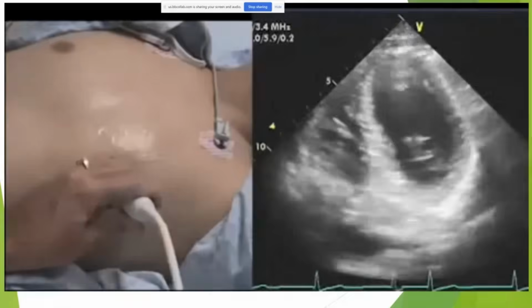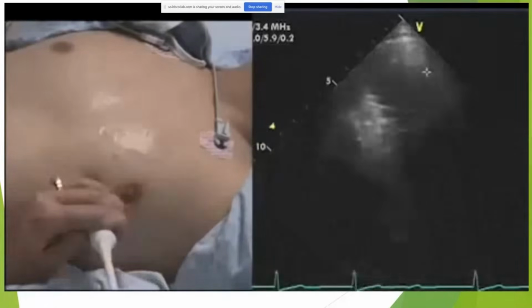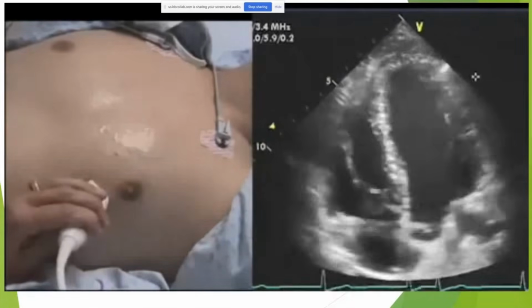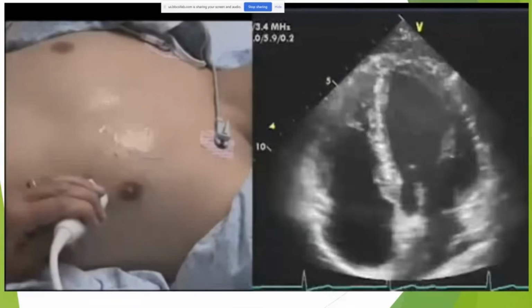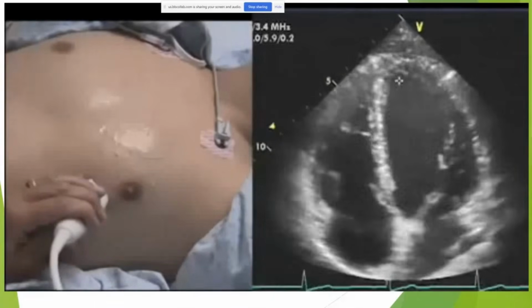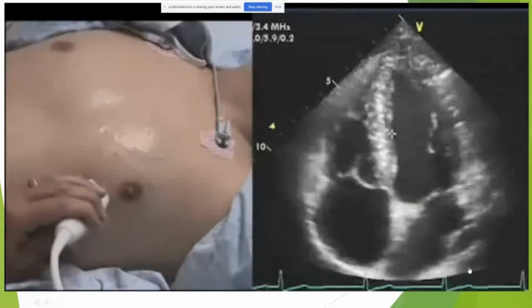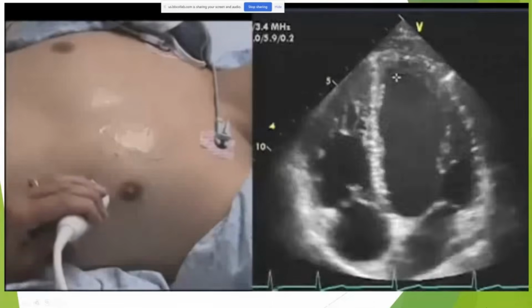So often, in this case as well, you need to find a lower window and angle steeper, angle higher up into the chest to open up the apex. So now you can see here is a perfect apical shot. It's almost pinching off there. If you look compared to the cursor, it's not coming in the way the sidewall is or the way the short axis does. It's nearly pinching off. That means we've got a nice shot of the apex.